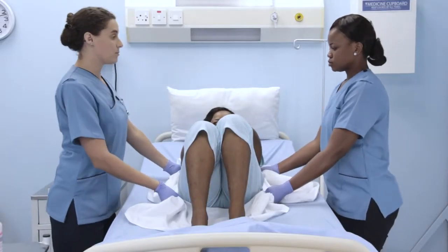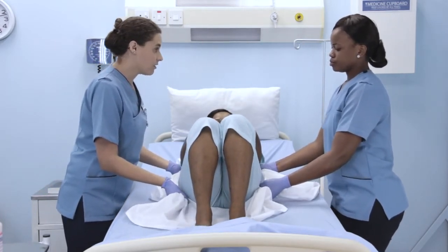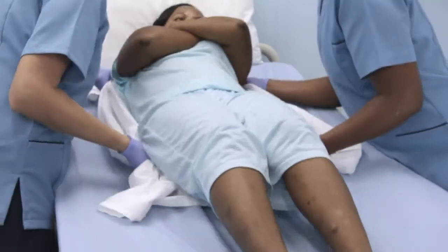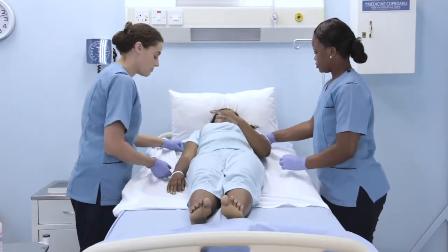You will shift your weight from your back leg to your front leg as you move the patient up in bed. Both care providers should move simultaneously. If possible, the patient can assist with the move by pushing with their legs. Repeat this process if necessary to get the patient in the right position.